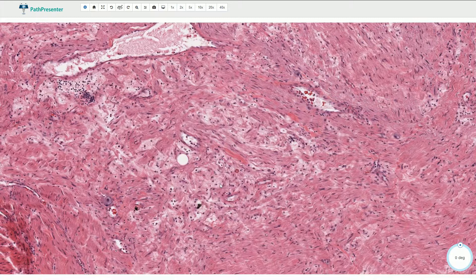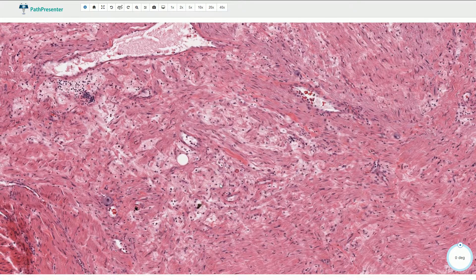It is part of the spectrum of neuroblastic tumors, with neuroblastoma being the poorly differentiated malignant tumor, ganglioneuroblastoma with intermediate differentiation, and this ganglioneuroma being the most differentiated and well-differentiated benign tumor.